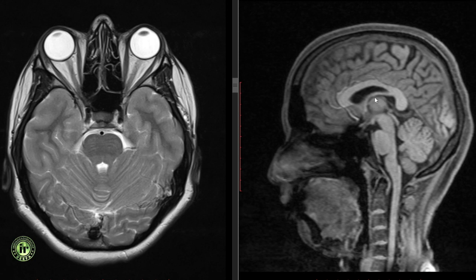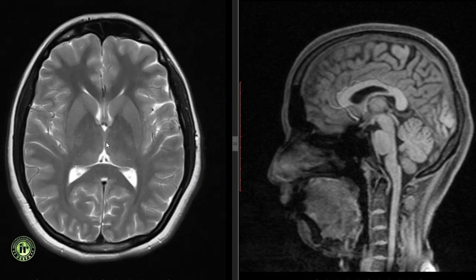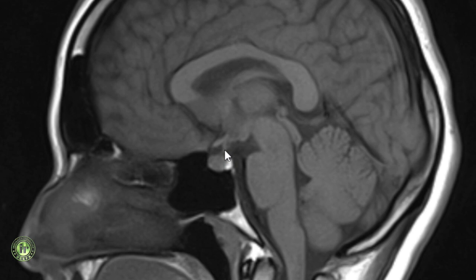The thalami are olive-shaped paired nuclear masses forming the lateral walls of the third ventricle. They are opposed in the midline at the massa intermedia or interthalamic adhesion and are separated from the lentiform nuclei by the posterior limb of the internal capsule. The pulvinar projects over the midbrain. The hypothalamus forms part of the floor and lateral walls of the third ventricle. The infundibulum lies posterior to the optic chiasm and passes to the pituitary gland; its width should not exceed that of the basilar artery.